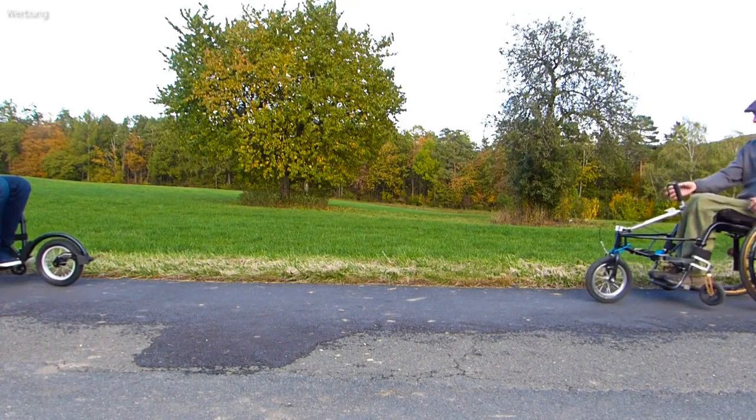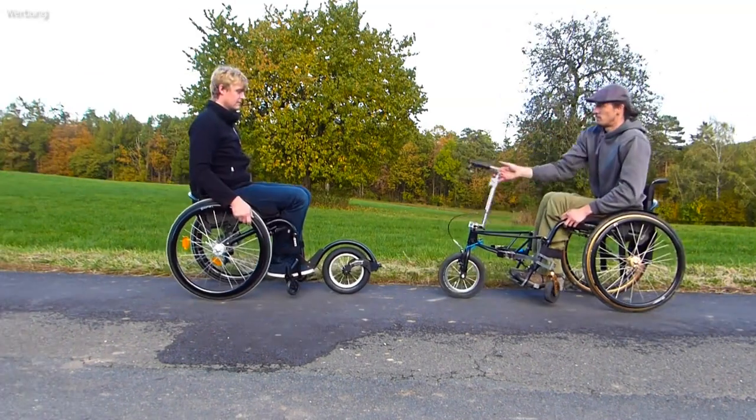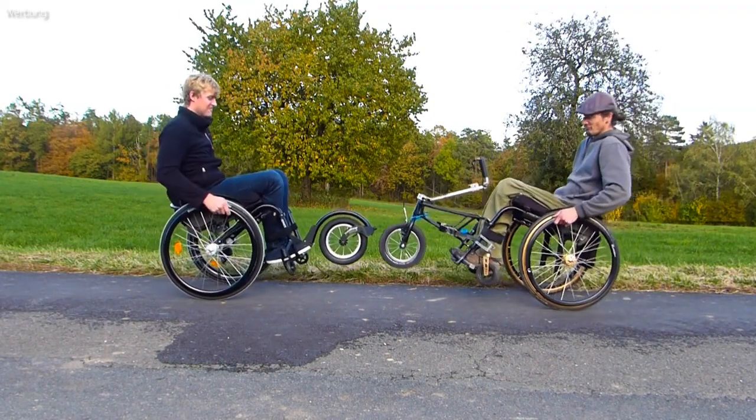We are often asked why we developed a front wheel and how it differs from others. That's what this video is about. Have fun — it starts after the intro.